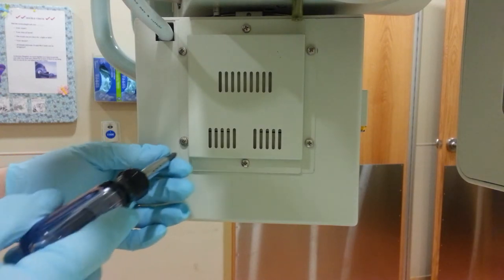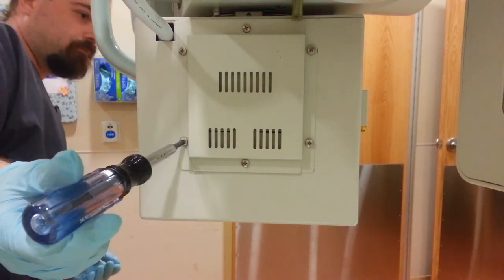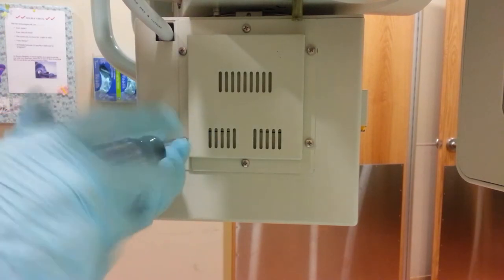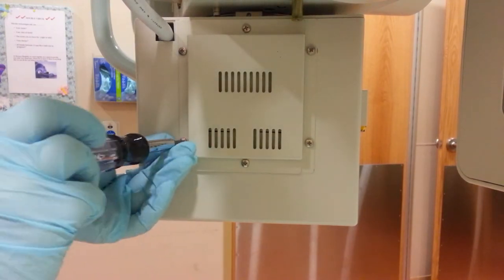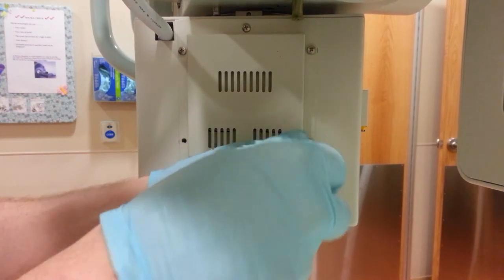This is how to remove a light bulb from a Shimadzu x-ray machine. I'll go ahead and remove the screws from the housing here, located on the side of the body.